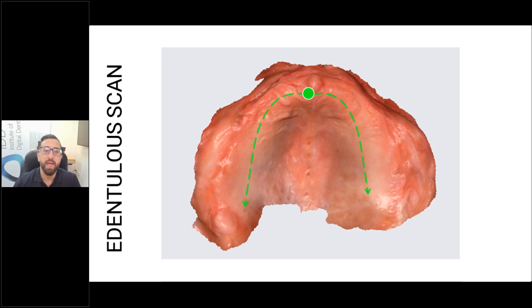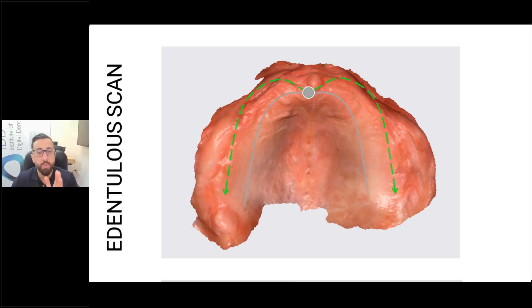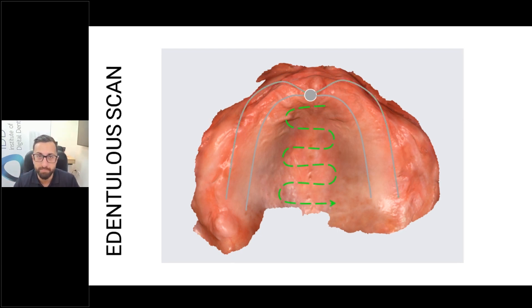You start on the rugae and build the whole scan up. Then you continue to go back to the rugae, scan more of the maxillary arch, scan more of the residual ridge, and start moving towards the buccal. Lastly, you scan the palate. There are all sorts of different scan strategies out there for edentulous arches — Professor Lauret-Rousseau has some, every company has some. The most important thing is that you follow some strategy rather than doing it haphazardly.